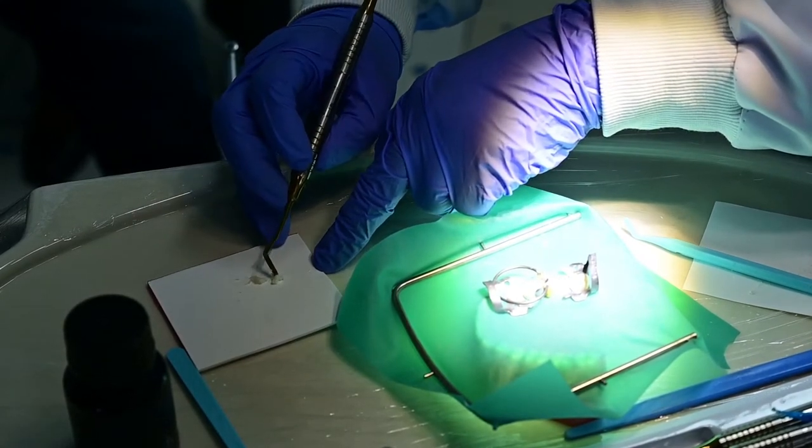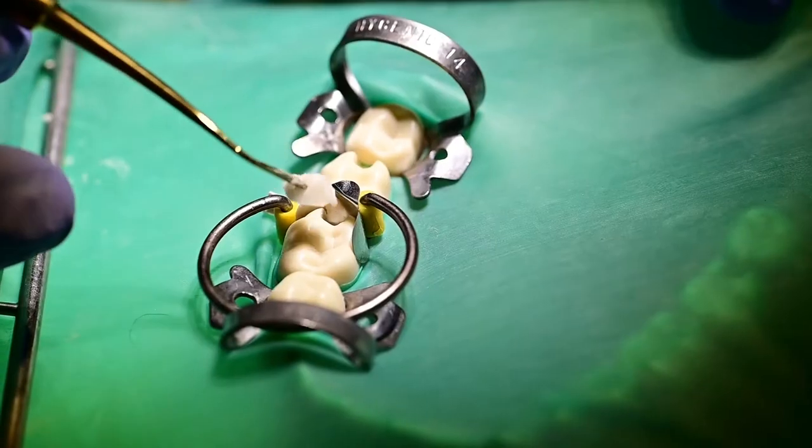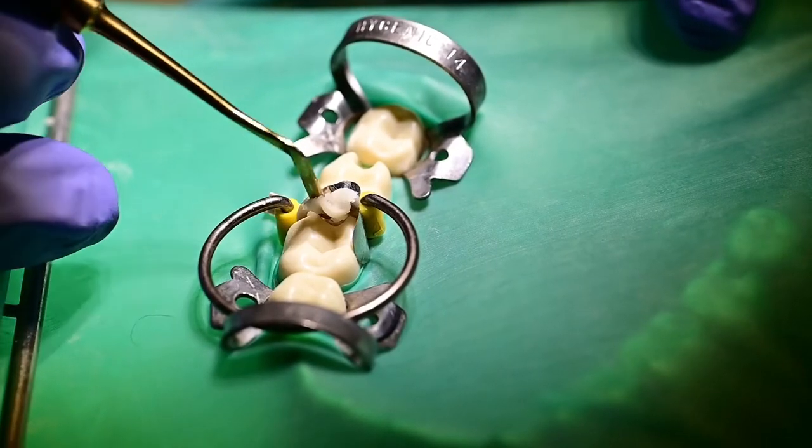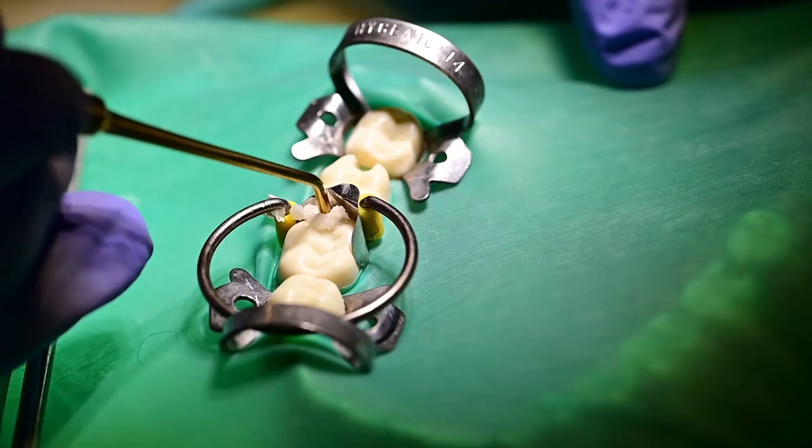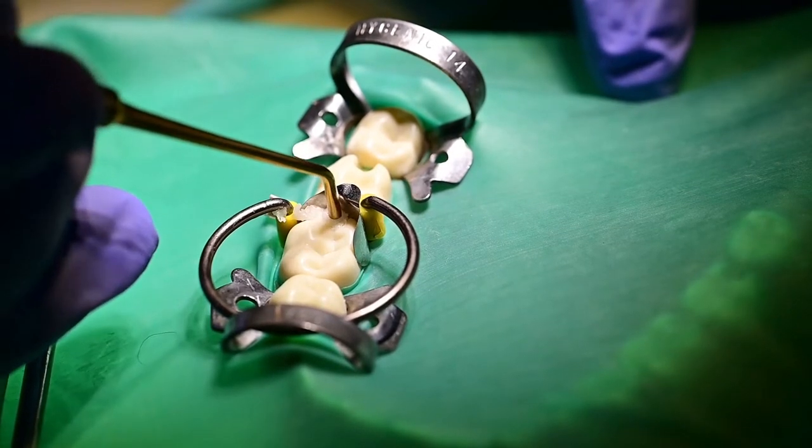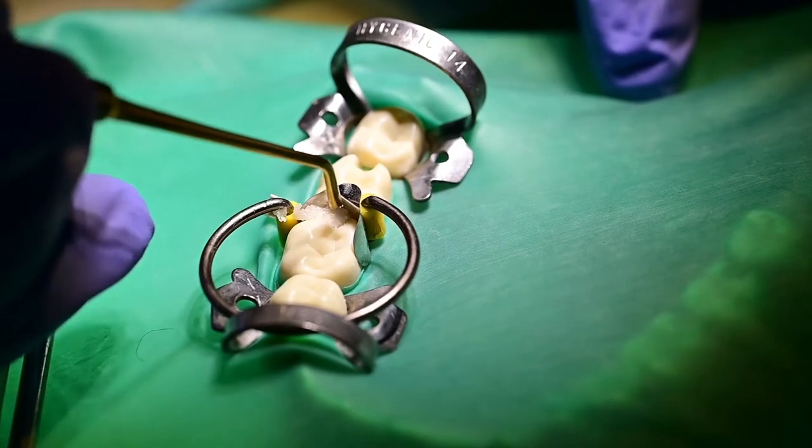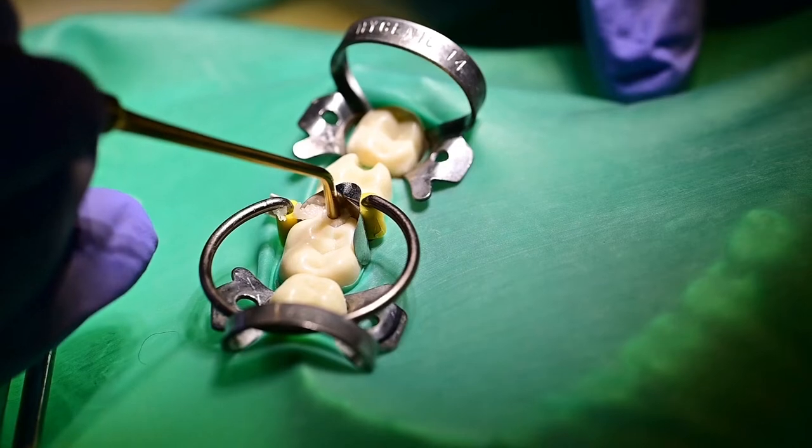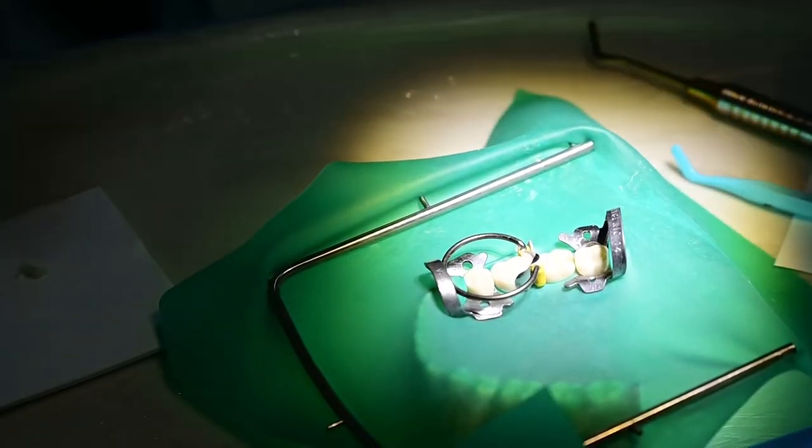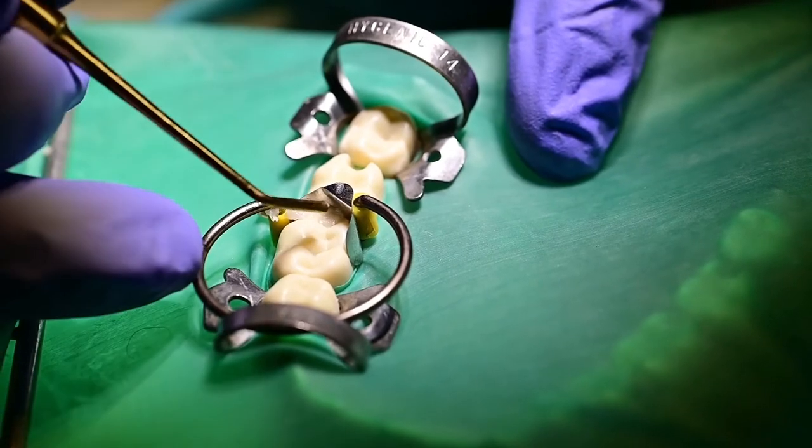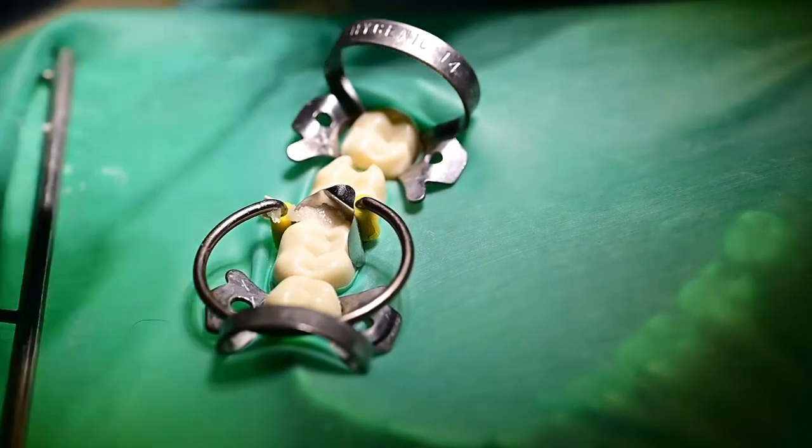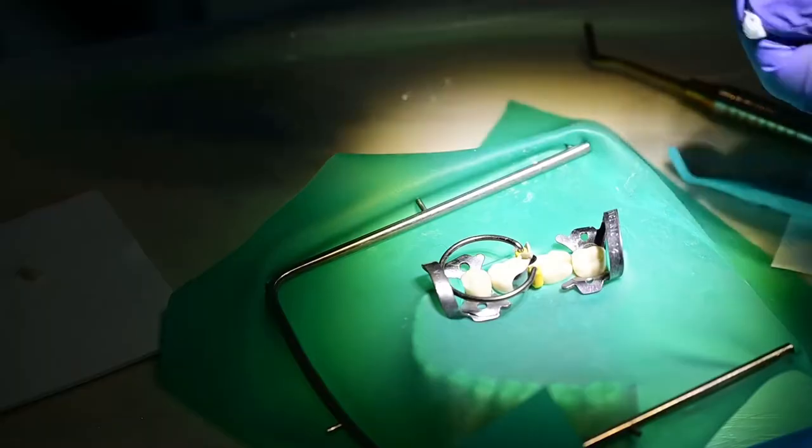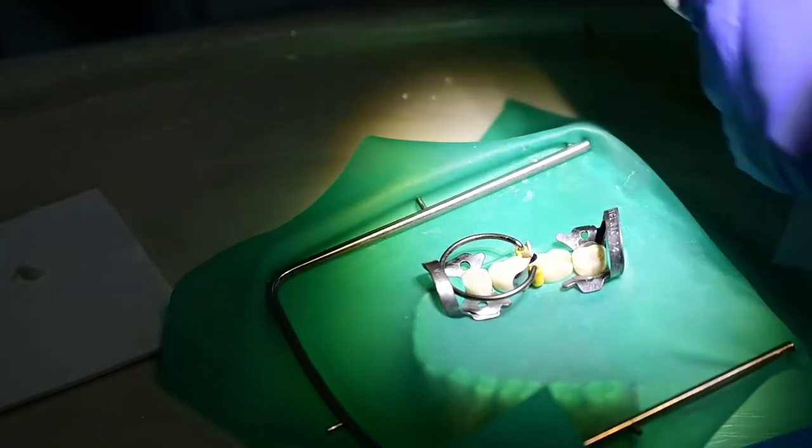I have my spatula. And as I shared the other time, just hold with a small surface area so that you can easily release it into the cavity. And I always wipe my instrument. So you pack it. This material should be contoured after the shiny surface has become dull. And it is another bulk fill type of material with unlimited depth of cure. So another bulk material. In fact it is also referred to as a bulk fill alkasite. And one scoop can give you pretty enough material for most of the cavities that you will be filling.